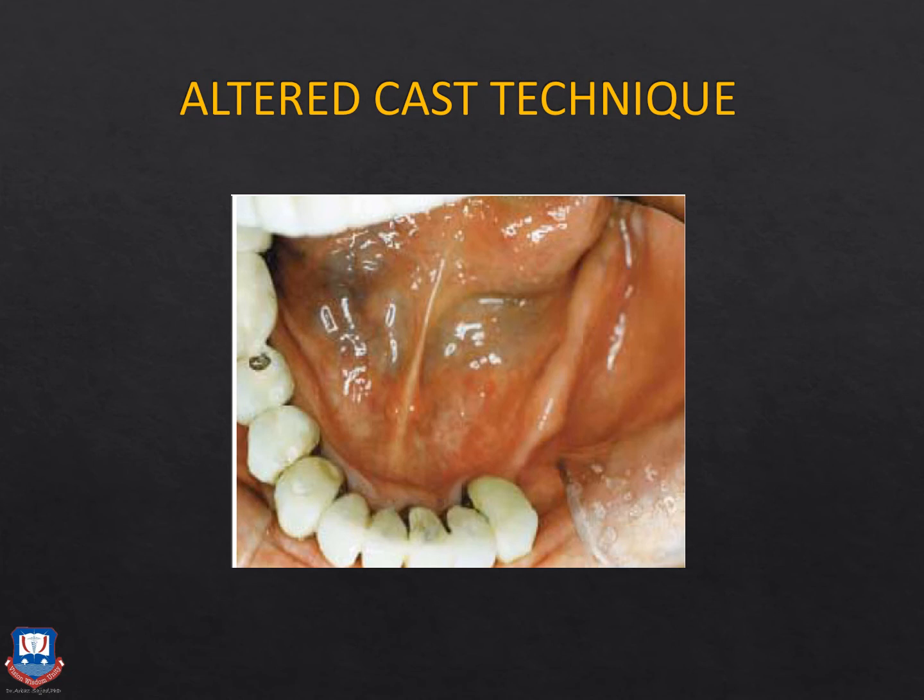This is an impression technique which is done after the master cast has been fabricated. All the previous impression techniques, including selective pressure impression techniques, are taken to fabricate a master cast on which the final denture will be fabricated, except the functional relining technique, which, you remember, is done after the fabrication of the cast partial denture. Whereas the altered cast impression technique is a technique to modify the master cast. That's why it is called the altered cast or corrected cast impression technique.